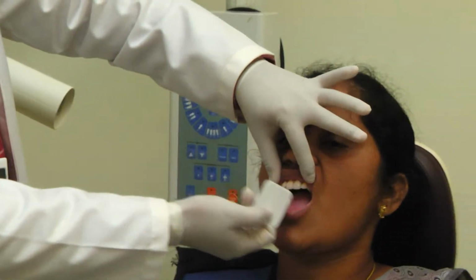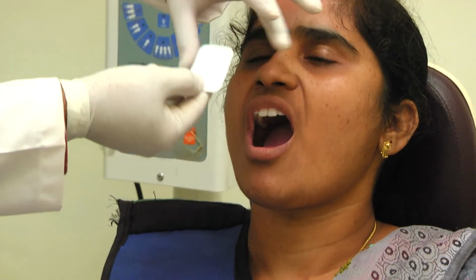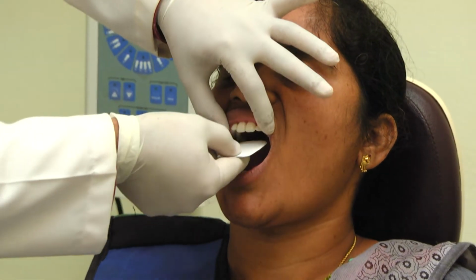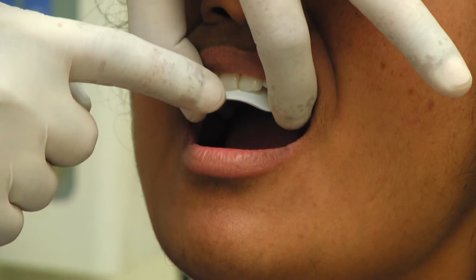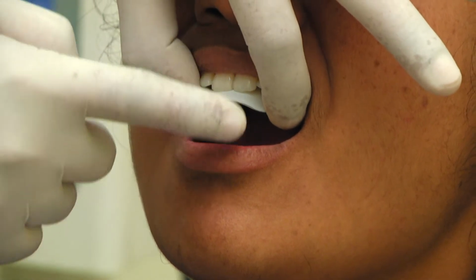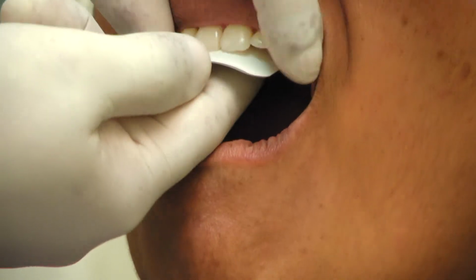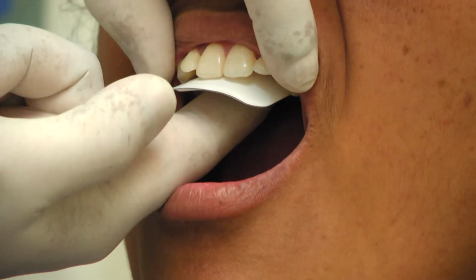So when you are taking it for the maxillary central incisors, place the film in such a way that the raised dot or knob is towards the incisal edge, and always the inferior edge of the film is 2 to 3 mm beyond the occlusal or incisal surfaces, so that the incisal or occlusal surfaces will be incorporated in the final radiograph. So this is how you need to place the film for the maxillary anterior teeth.